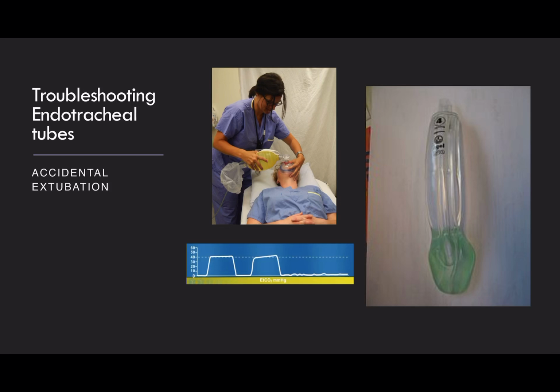And I keep emphasizing this, but every patient should have end-tidal CO2 monitoring. And you can see the graph in the bottom there of this slide, where you can see two normal rectangles of the end-tidal CO2, and then suddenly it goes flat. And the reason for it suddenly going flat is that the tube has suddenly come out of the trachea and there is no longer exhaled air with carbon dioxide coming through the tube and into the ventilator to be detected. And this patient has therefore self-extubated.